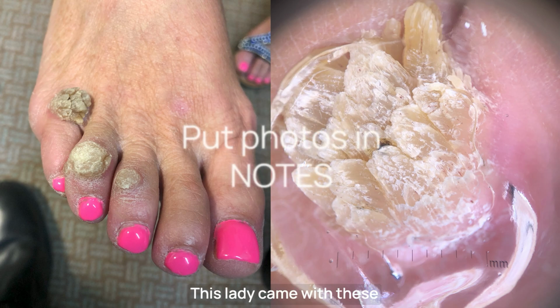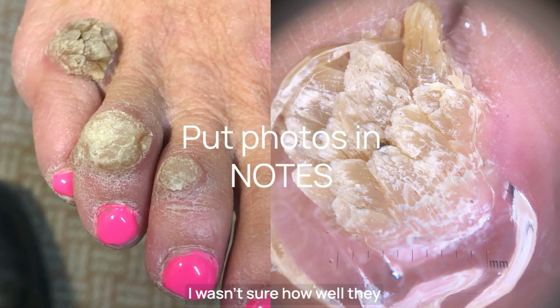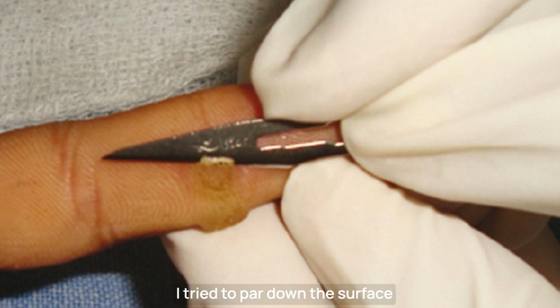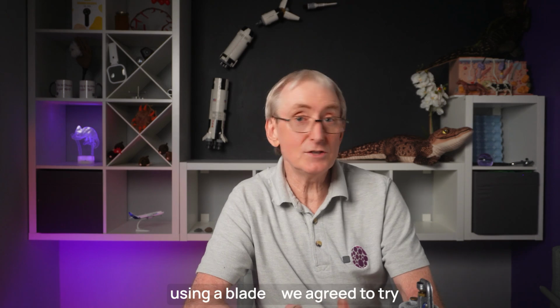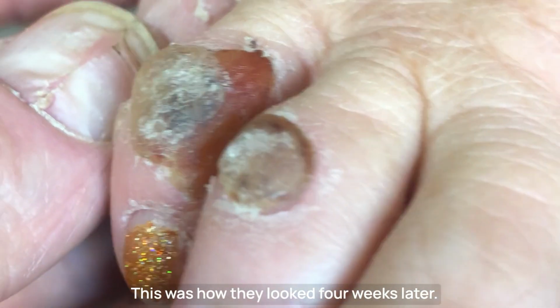This lady came with these horrible warts on her toes. It was painful when she was wearing shoes. I wasn't sure how well they would respond to cryotherapy, so initially I just gave one a 30-second freeze and reviewed her 3 weeks later. Nothing had changed. I tried to pare down the surface using a blade, but they were far too hard. We agreed to try 2 30-second freeze-thaw cycles. This was how they looked 4 weeks later.